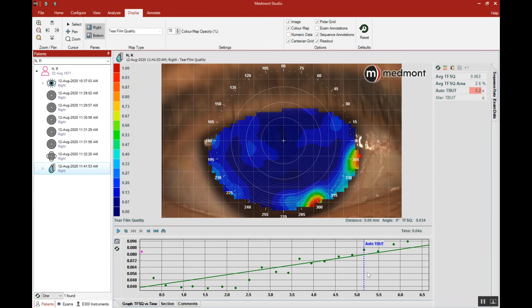We are able to recognize the tear film breakup time non-invasively, without using dyes that might change the natural homeostasis of the tear film. This test can be a helpful tool to appreciate the non-invasive tear film breakup time of your patients.